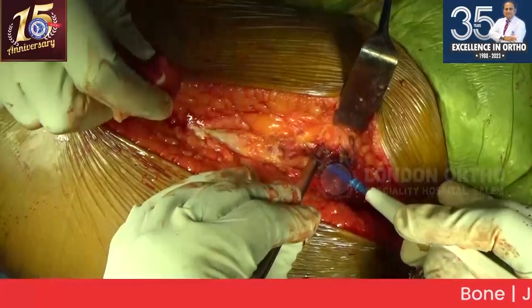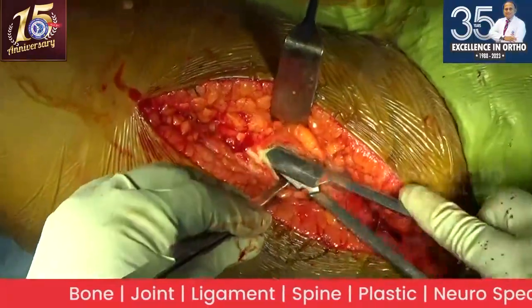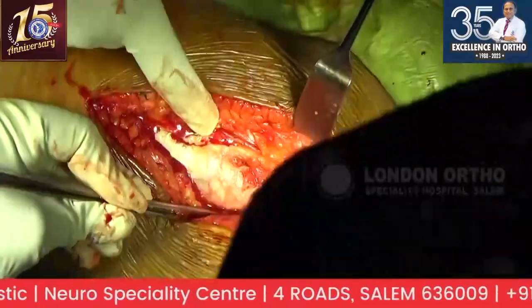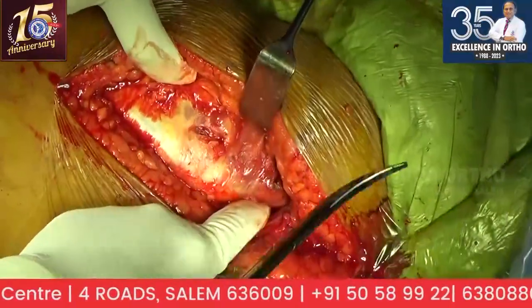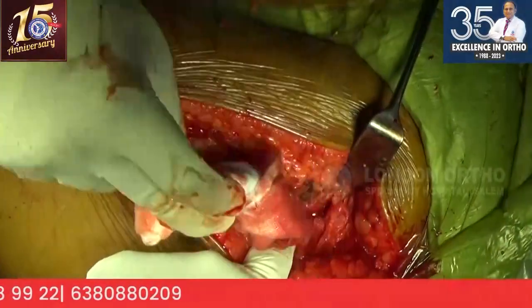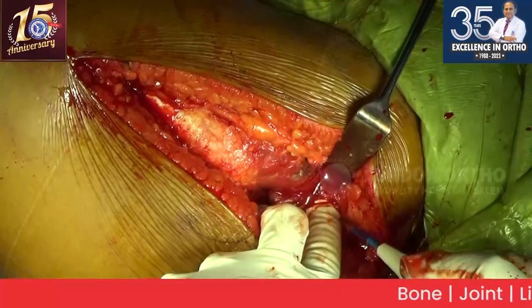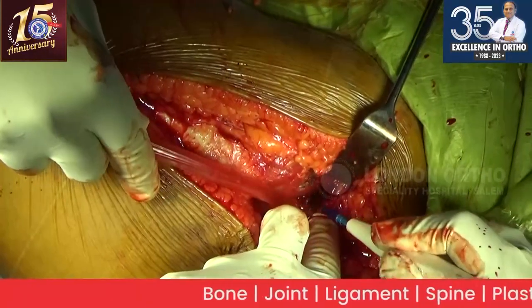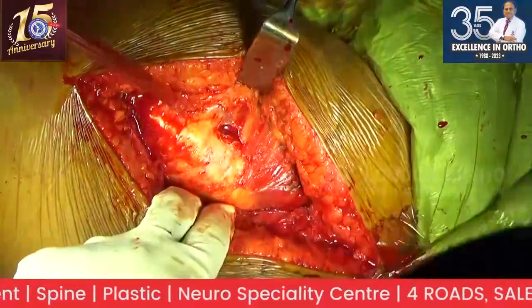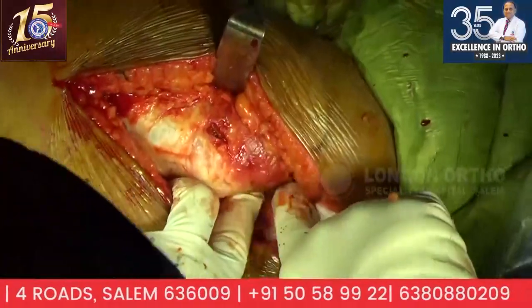So, a young girl, unmarried. Even I was trying to postpone the surgery, but she's really suffering so much, she just wouldn't discuss any other option. You said cemented femoral stem? Because it is 124 degrees, we don't have a low offset uncemented. Sir, in your preoperative planning, what are the things you have in mind, apart from the offset and the femoral stem? The acetabulum side, it's not completely shallow. I should be able to reach the original floor and the teardrop lower point fairly easily, I feel. But how much the femur is going to come down is the question we need to work on. So in your approach, what are the things you want to release to get the length?